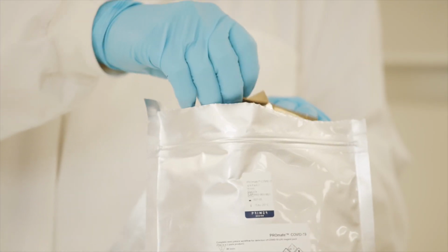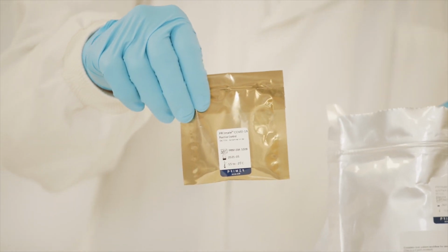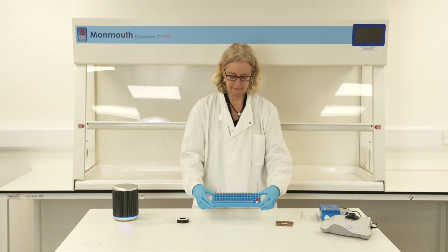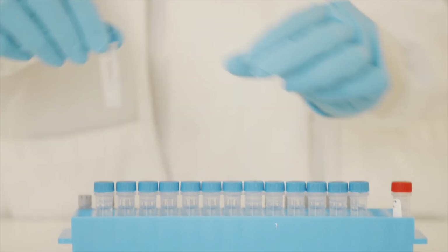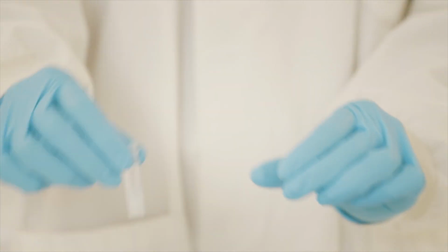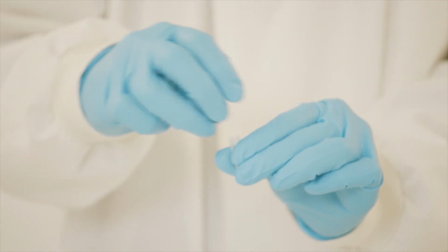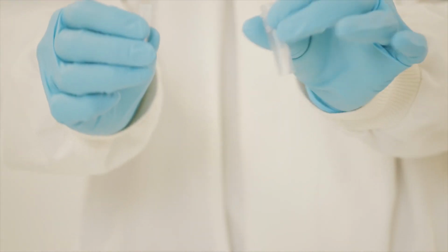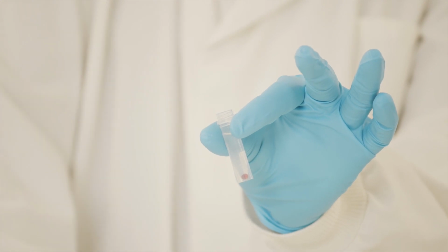The positive control comes sealed in a gold foil and should only be opened prior to loading on the qPCR instrument. Sample preparation tubes should be labelled with the relevant sample ID. One lyophilized RNase inhibitor cake with the red bead should be added to each sample preparation buffer tube required for the run. The coloured bead provides easy identification that the inhibitor has been added. The tubes are then ready for the patient swabs.